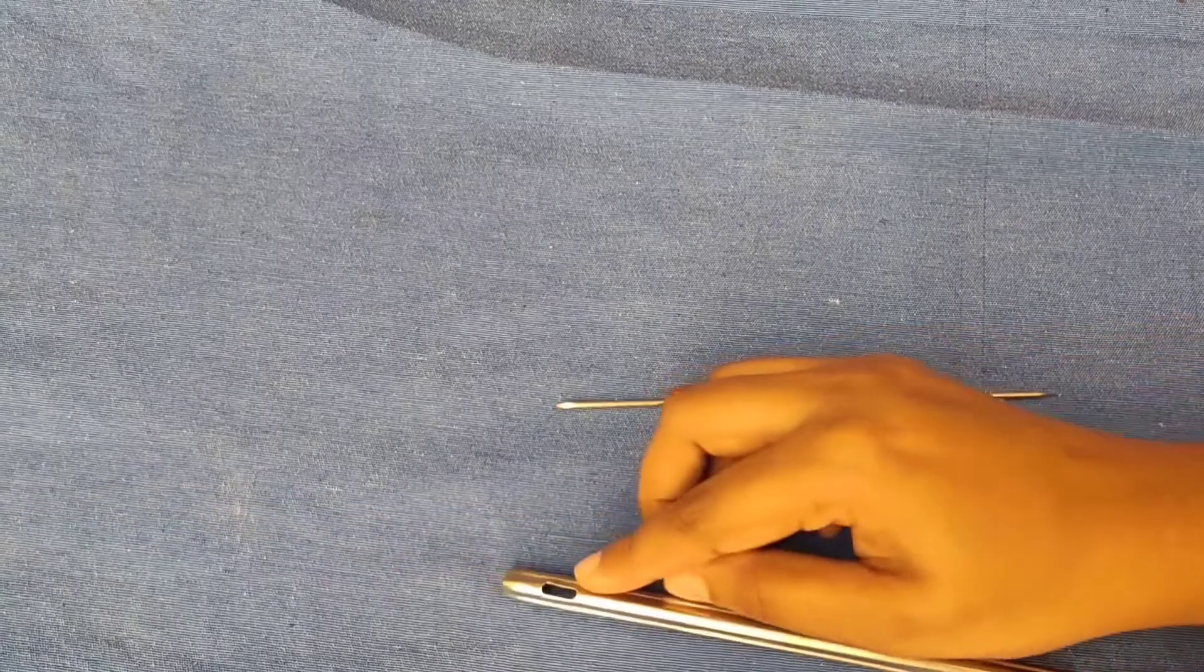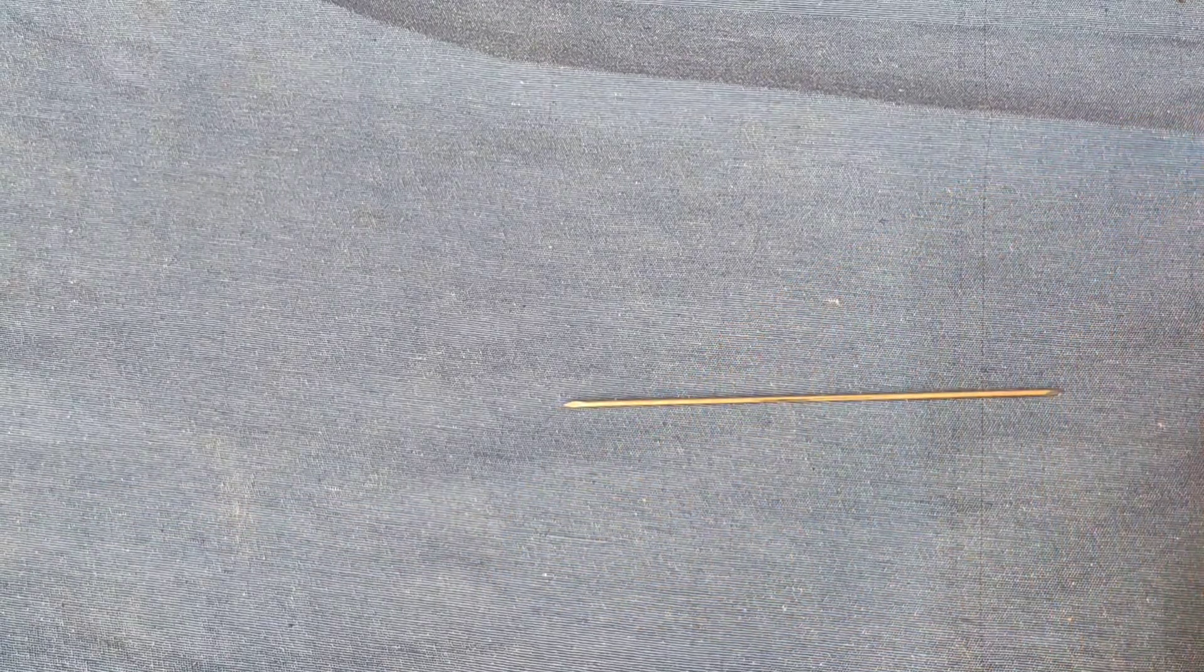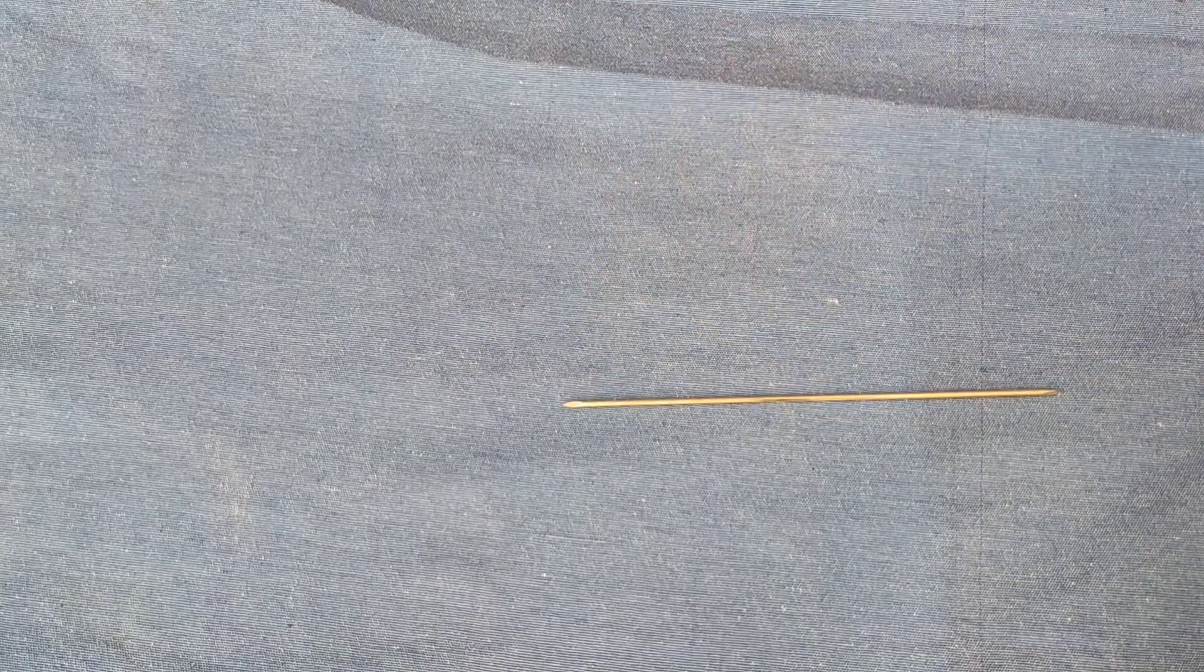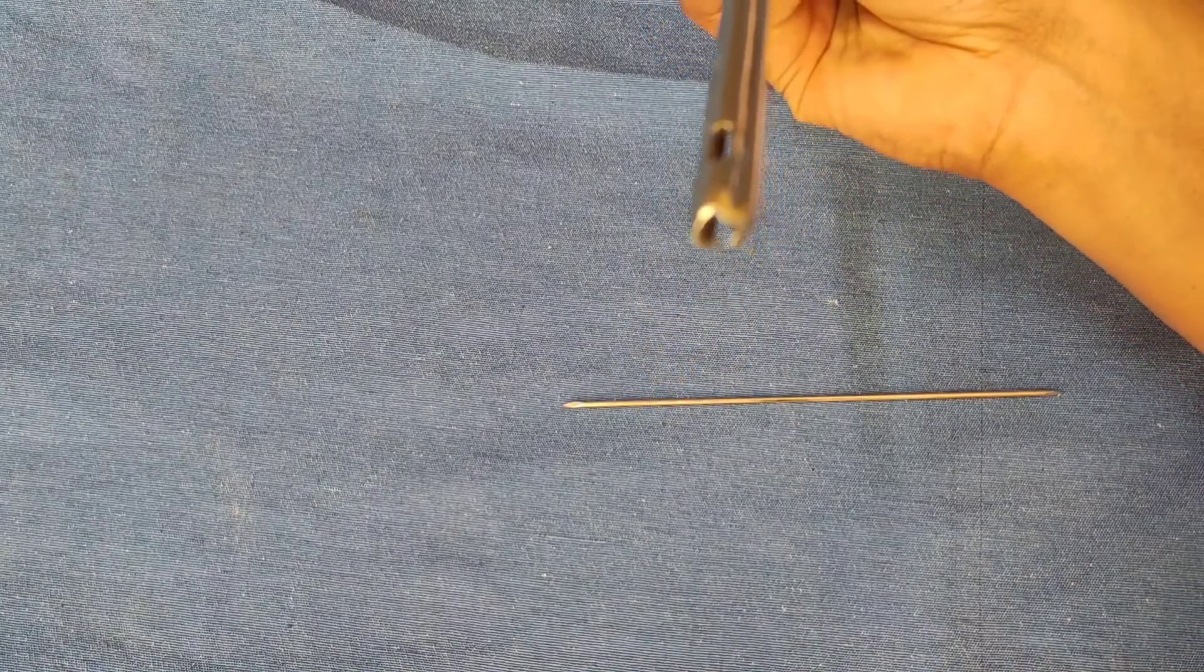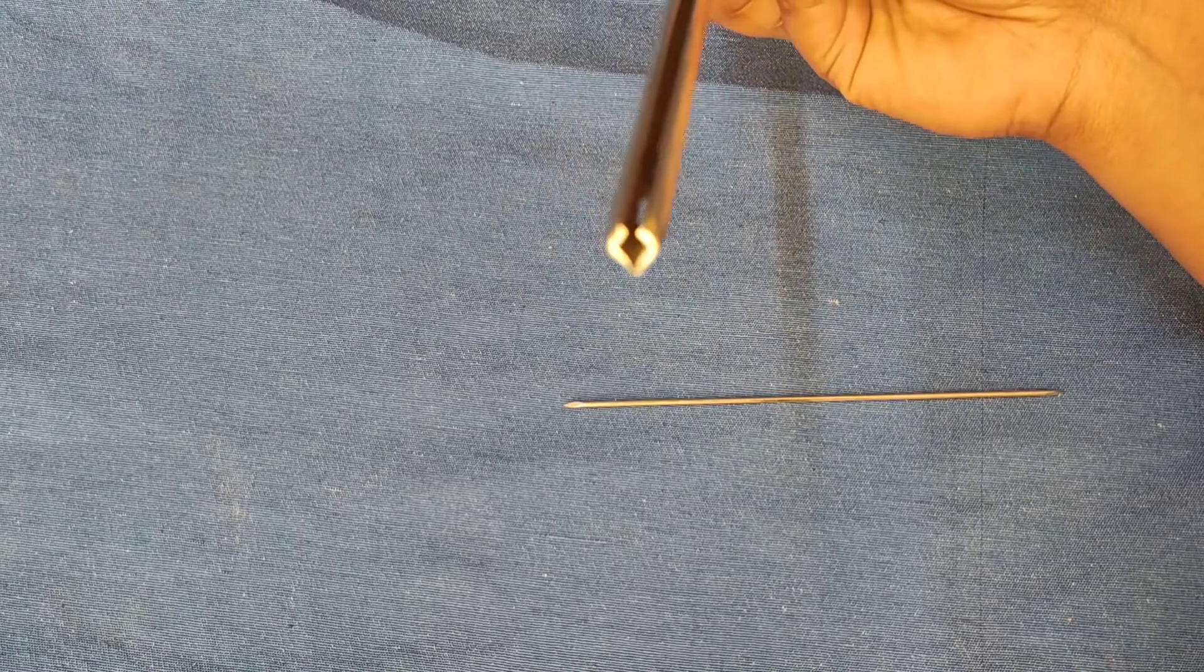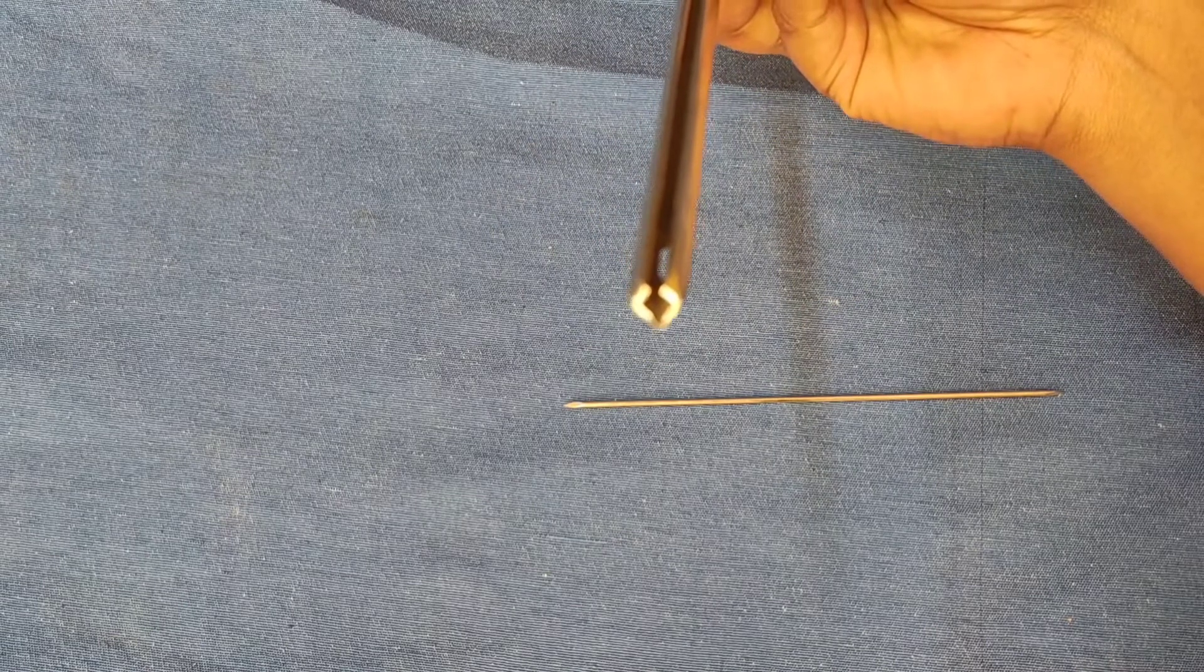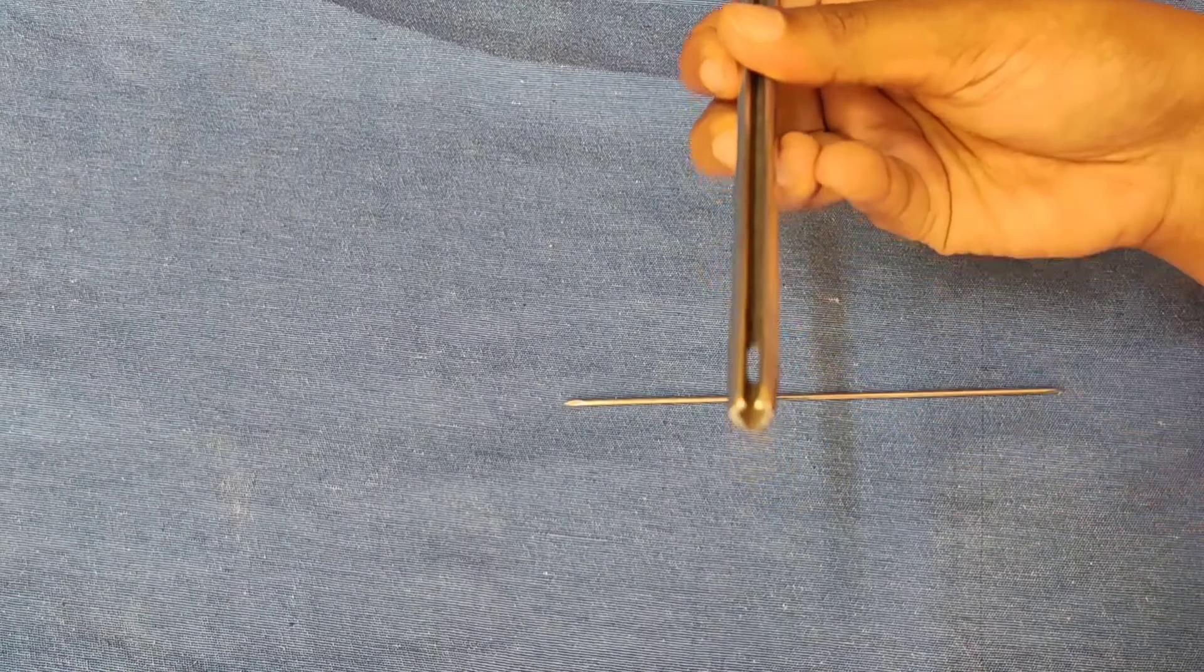Determination of length of the nail by measuring from tip of greater trochanter to upper part of patella. Method of nail insertion either by retrograde entry or antegrade entry from piriformis fossa. The disadvantage: it does not provide rotational stability and there is no locking mechanism.